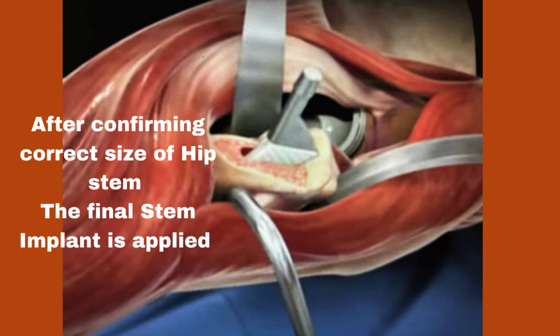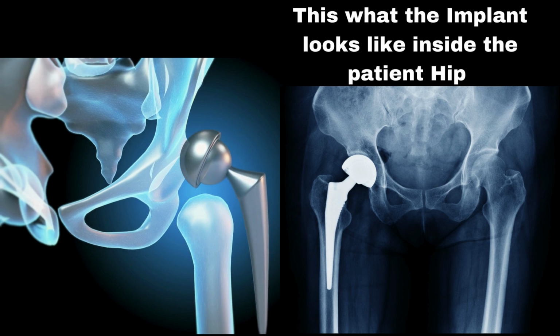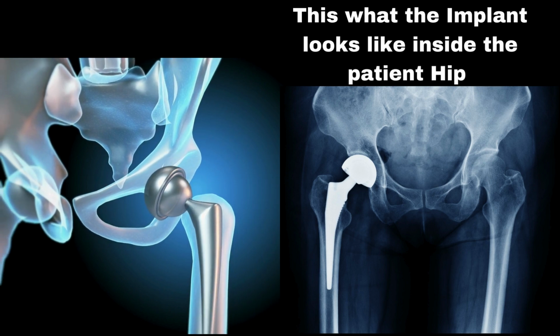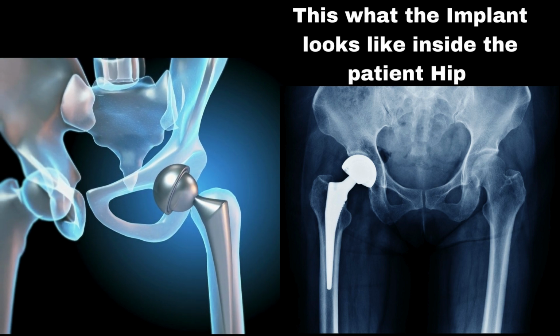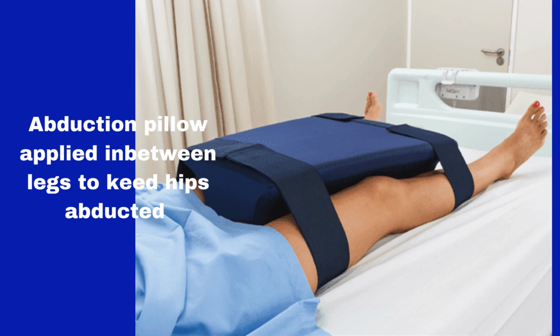After confirming correct size of hip stem, the final stem implant is applied and the surgeon inserts the final ball into the new socket, checking again for ease of movement, potential for dislocation, and restoration of the proper anatomy of the hip, including the leg length. Then X-rays may be taken to assure proper sizing and positioning of the components. The wound is closed and dressing applied. Post-op, the abduction pillow is applied between the legs to keep the hips abducted.